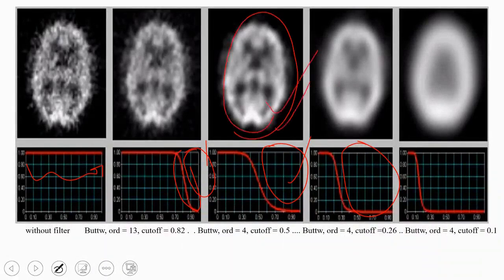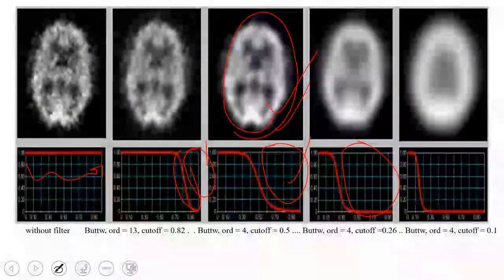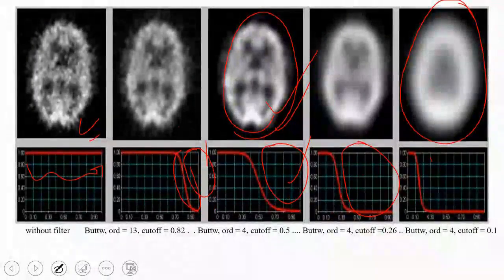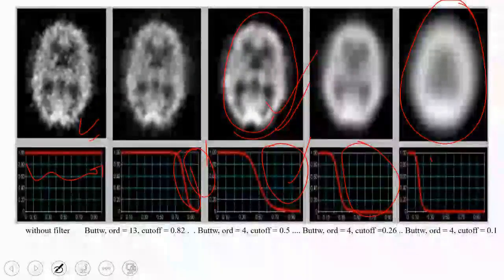For me, as Islam, for example, this would be very optimum to work on. But someone else might work on this, but it's very noisy. It's noisy, but there's no data in it. You took a very smooth image, so you removed the frequencies of the data from the patient. This is fine. The frequency game happens in post-processing, of course. After the image is taken, work begins on it, and the analysis starts.